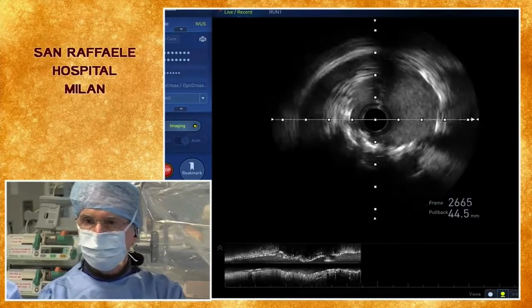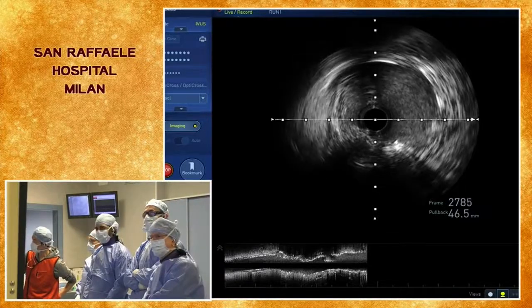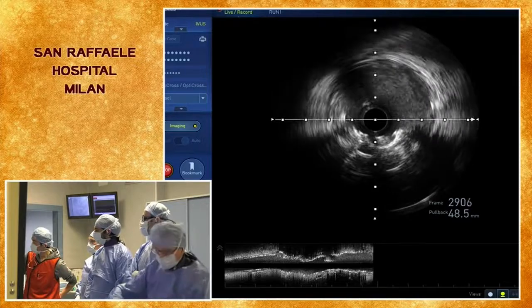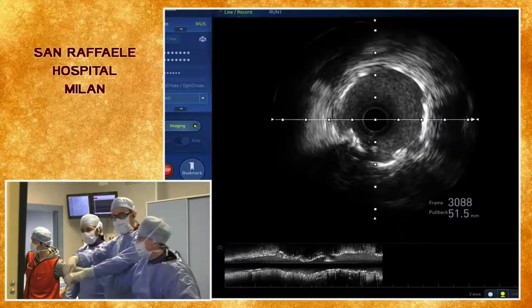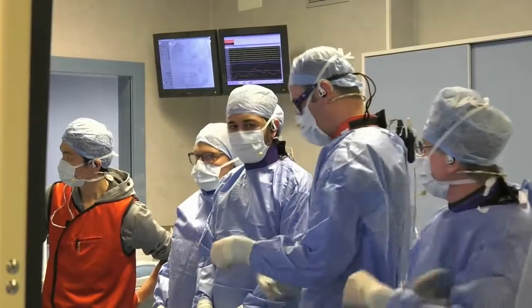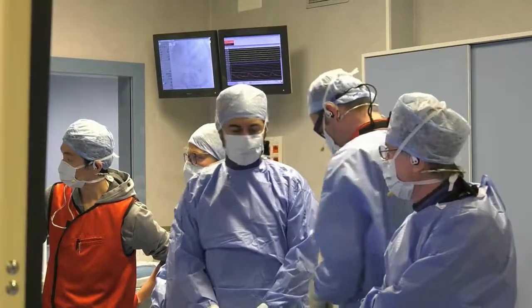Now another diagonal is coming. Yeah. Very open. Very nice lumen. I like that. You're close to the proximal. I don't think we need to post dilate. I think so far very expanded. There's no malapposition. We can remove the wire from the diagonal. We're going to take a final picture just to demonstrate that the diagonal stays open. You want to give nitro? So? Yeah, let's give some nitro.